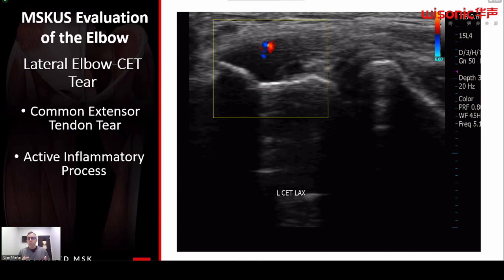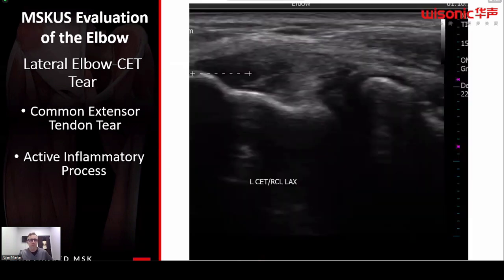What we care about in this instance is that you can use that flow or motion to detect inflammation or even any disease processes in here. It'll have a speckling effect, not that constant flow you would see from arterial spaces, but that speckling. And that would be a good indicator that there's active inflammation there.